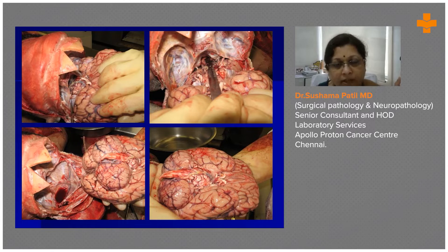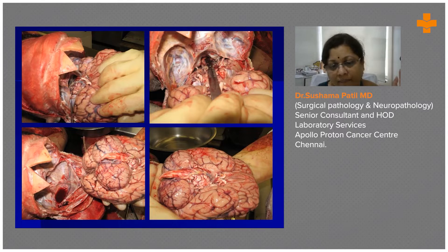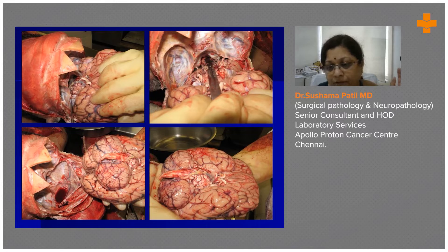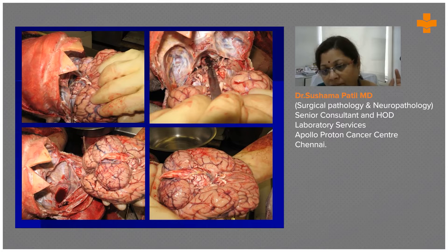Once we deliver the brain — cut the tentorium, go as deep as possible, sever the spinal cord — we deliver the brain intact. Here we have the cerebellar hemispheres, the cerebral hemispheres, and the brainstem. You can see the basilar and vertebral arteries joining, the atherosclerotic plaques now much more visible, and the beautiful olfactory nerve with olfactory bulbs. These are the optic nerves forming the optic chiasm.